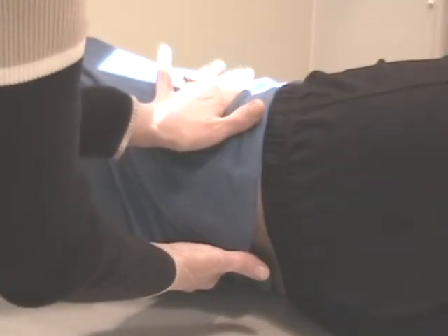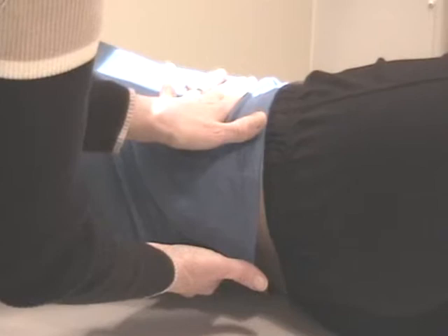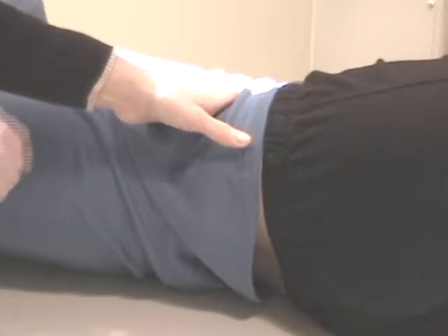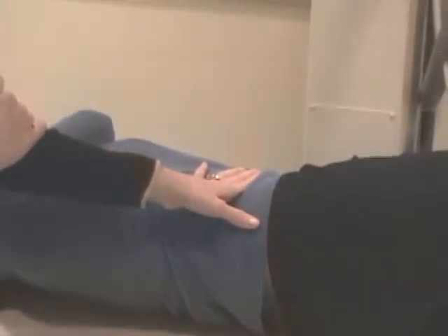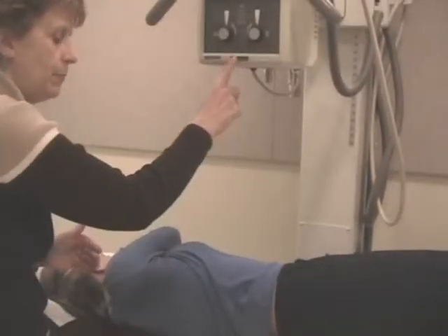So when I line this up, these fingers will give me a reference with what I'm feeling here, and I will know that the spine is centered to the film. And when I look at the patient, the heels of my hands are lined up. I don't know if you can see from this camera angle, but this crosshair here is just a little forward of my fingers. That has confirmed that I have the spine to the center of the film. So I'm very happy with how I've centered this side to side.